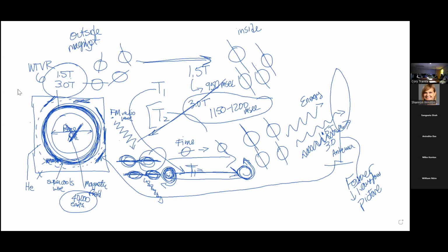Stainless steel. Stainless steel, I mean, you see them, you know, Dr. Canada has a bicycle in there all the time. That thing's got tons of metal in it. It's all aluminum and stainless steel. So there are certain metals that can go in there. There are certain oxygen tanks that can go in there, but most of them cannot, okay?